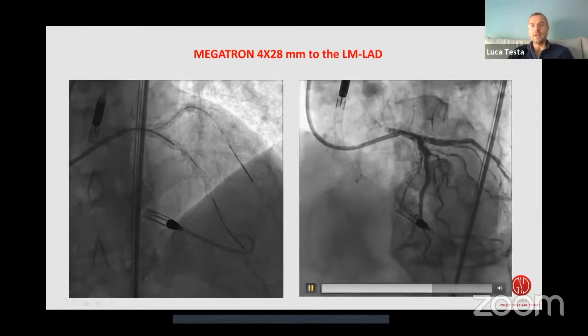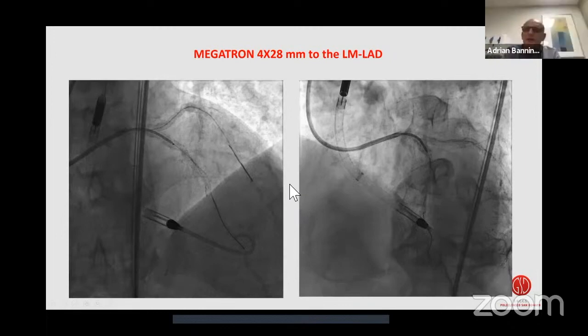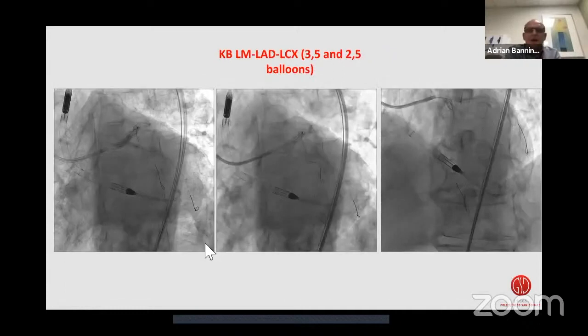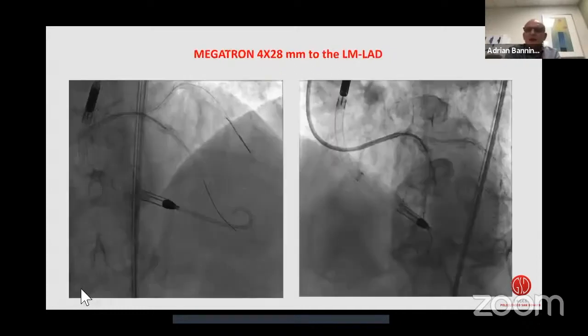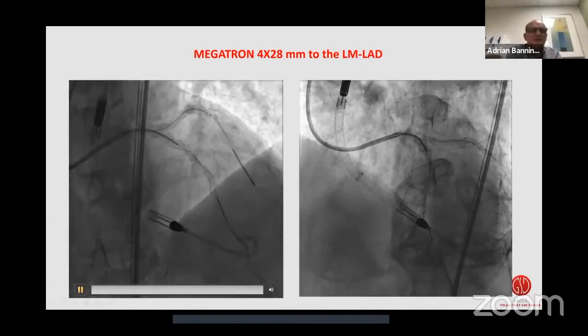The first one I chose, actually I thought it was enough, because my first intention was not to reach the ostial left main. This is also questionable. What is your practice? Do you always cover the ostial left main? Well, the original data from France was very persuasive that that's what we should be doing. I think the subsequent data has suggested that if the ostium of the main is not diseased, you don't have to cover it, particularly when they're big. I think you sometimes create a problem trying to get apposition of the stent.